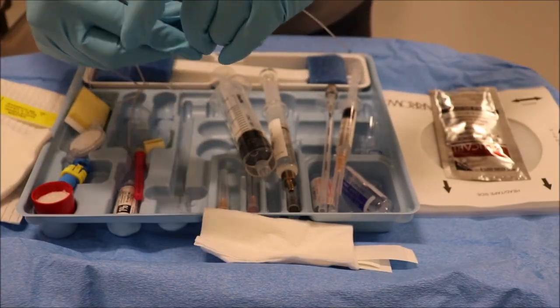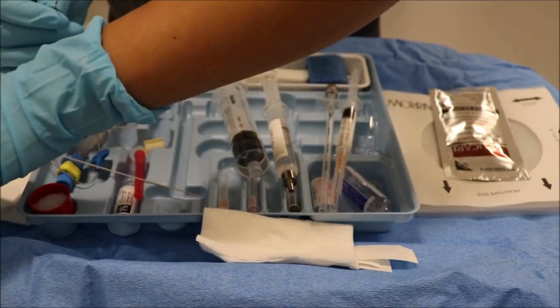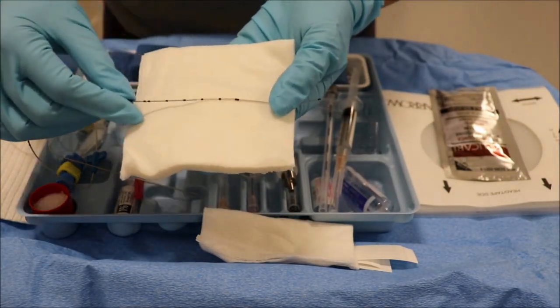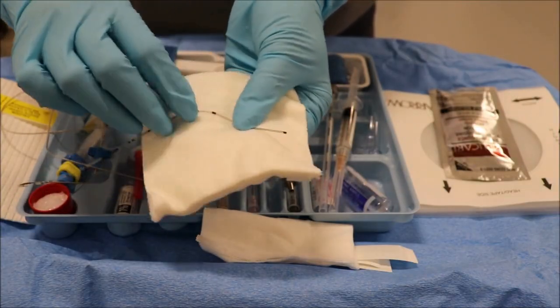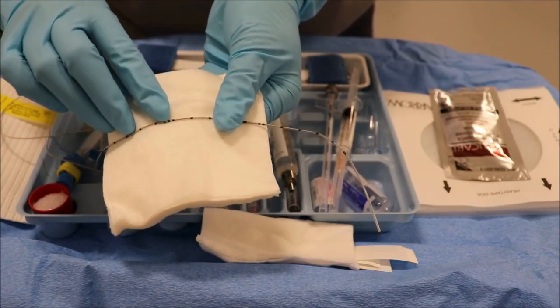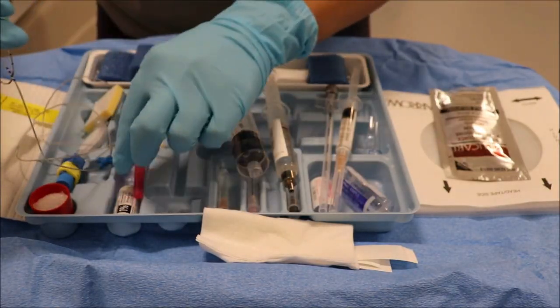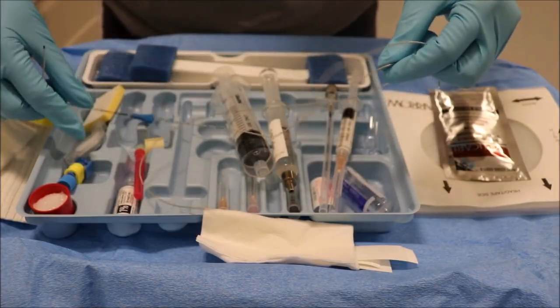The blue tip marks the start of the catheter, followed by a single dot at 5 cm, additional single dots at each subsequent centimeter up to 10 cm, marked by double dots, a wide blue band at 12 cm, then 3 closely spaced dots at 15 cm, and 4 closely spaced dots at 20 cm.